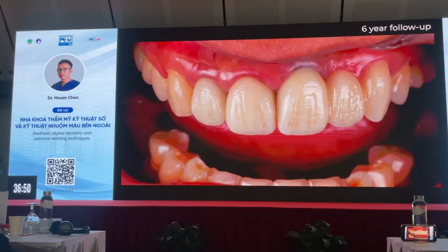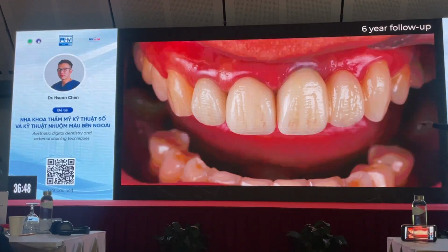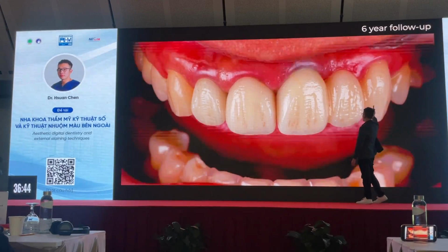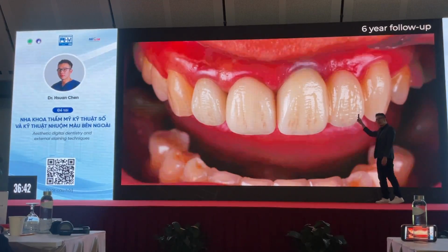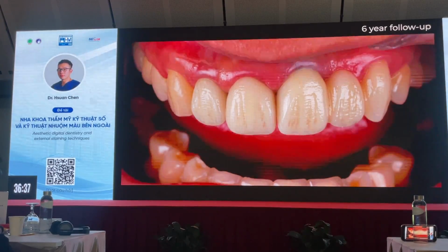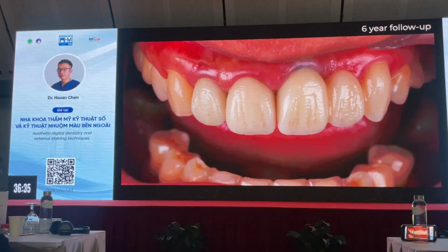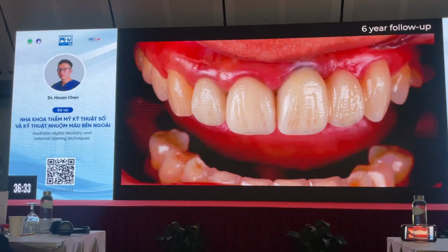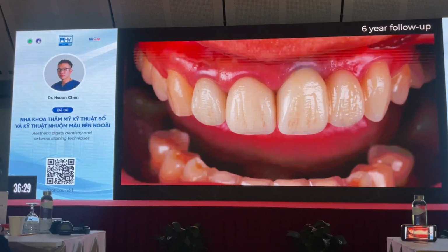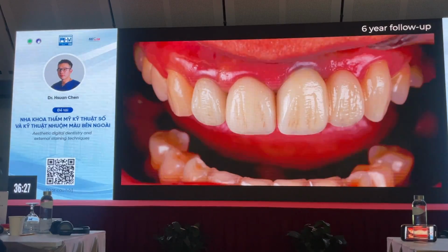So this is Emax. This is all Emax. This has an abutment inside. This is going to have an implant inside. So it's going to have a different material inside. And it's going to be much thicker as well. Right? I think there are a lot of confused faces, so I'm going to go through this and you're going to see why.